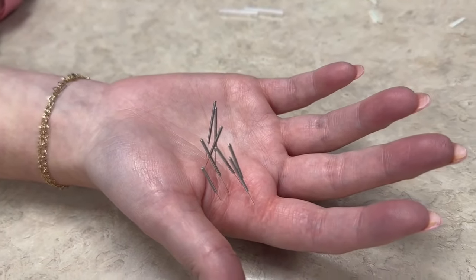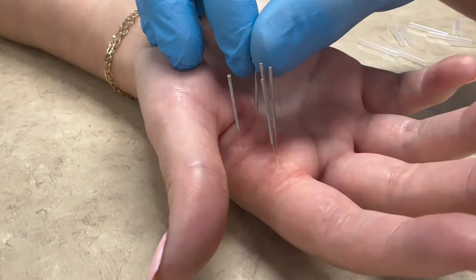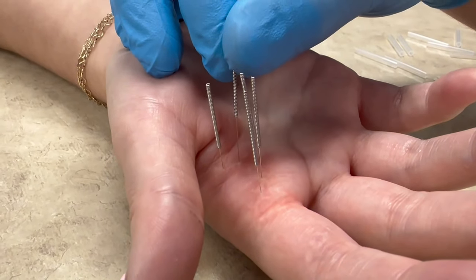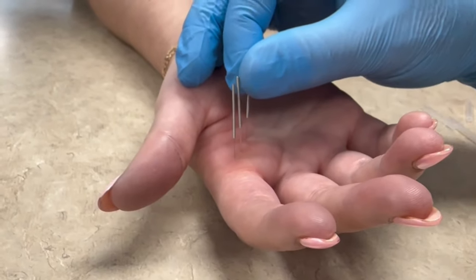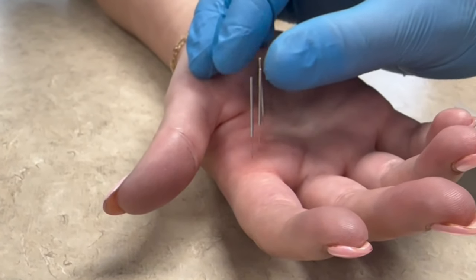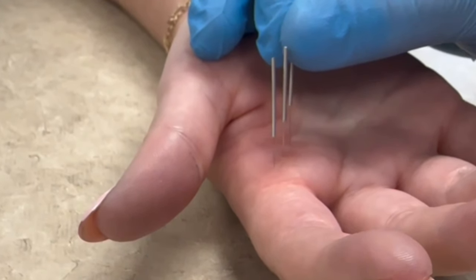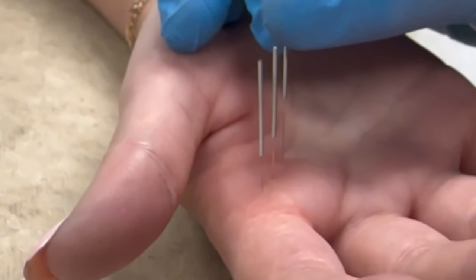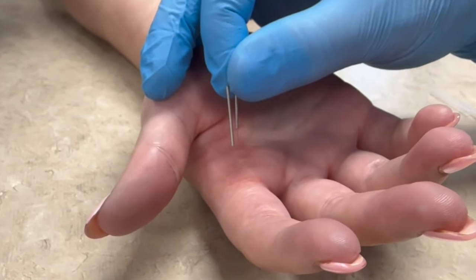After I twist them for a little bit, I can just let those sit. After the scar tissue's collagen is wound tight around the needle, you can lift the needle and visualize the rise of tissue within and around the scar. Lifting the tissue with the needle is another form of scar manipulation. Look at that - can you all see how that spread a good centimeter on each side of that scar? The crazy thing is this is just the tip - it's just barely in the scar. Look at that one - that's a good lift.